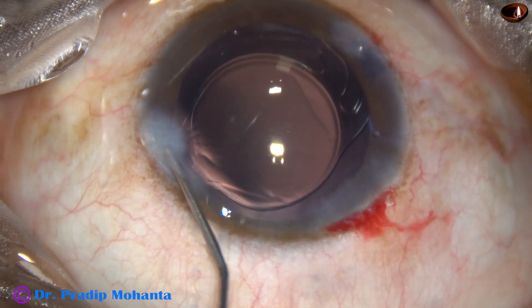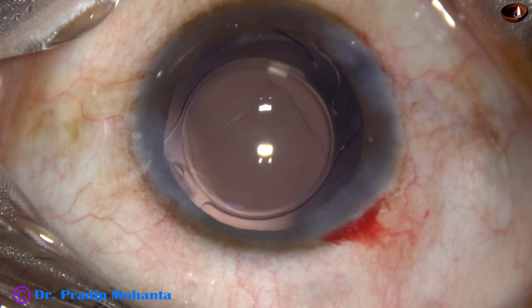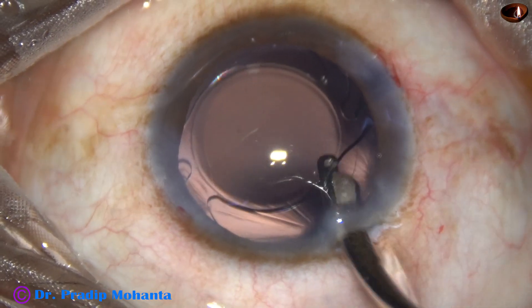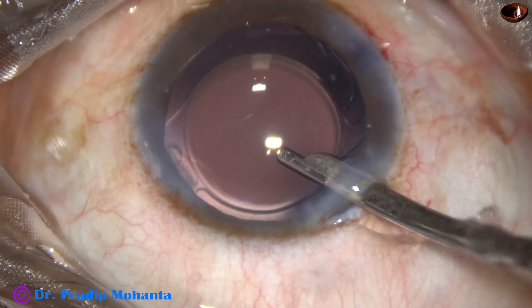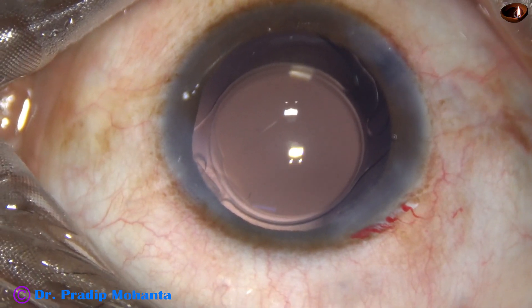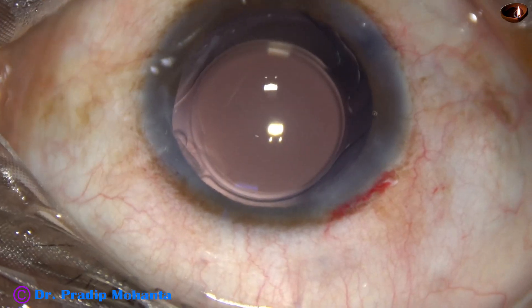The corneal stroma is hydrated to close the side ports. This is the final lavage of the anterior chamber — at this time, any viscoelastic substance sticking to the corneal endothelium is removed. The viscoelastic used in this case is 2% hydroxypropyl methylcellulose. The anterior chamber is nicely formed, and then the integrity of all the wounds is checked. A few drops of moxifloxacin are applied over the cornea, and the case is concluded.